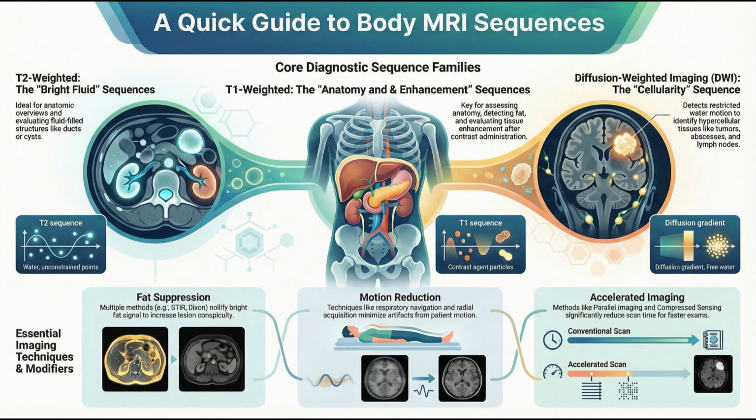The principle's the same, and it's really cool. Traditional MRI says we have to sample all of K-space. Right. CS says, no, you don't. It uses a semi-random undersampling of K-space, so we're deliberately taking only a tiny fraction of the data we thought we needed. And then what? How do you get an image from that?